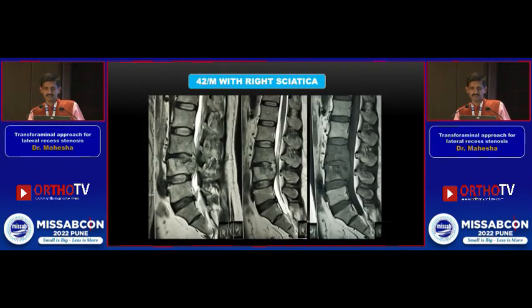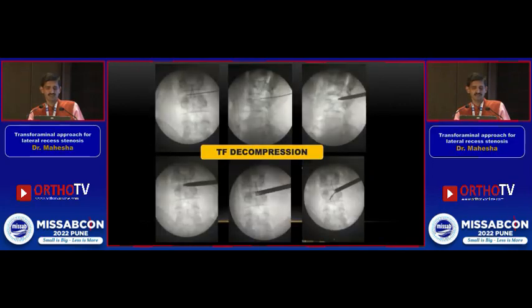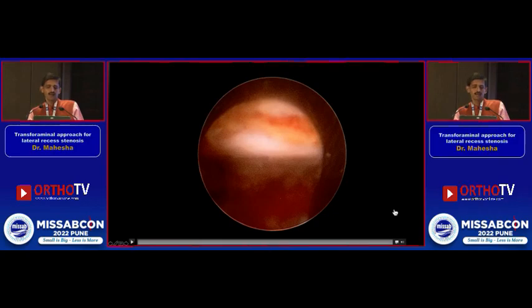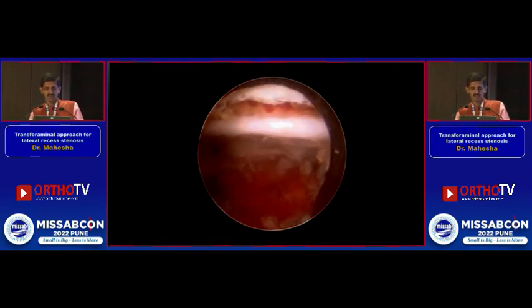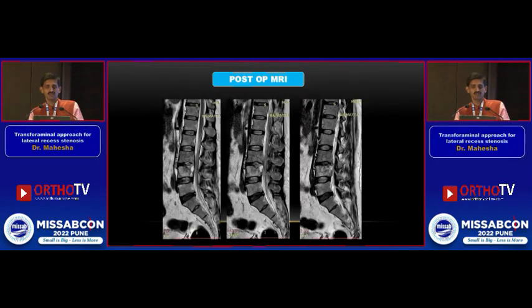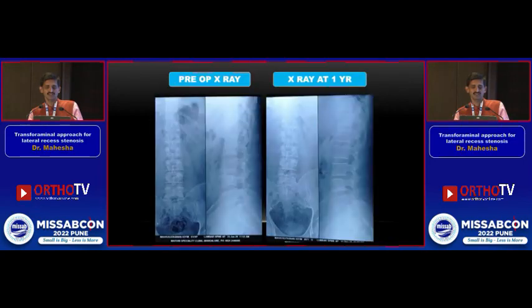This is the last case: a patient with tuberculosis spine on anti-tubercular treatment with severe radicular pain. At L3-4 level you can see the granulation tissue compressing the dura. This was done endoscopically, because the other option probably for him would have been fusion. At the end of decompression — it was not pus, it was all hard granulation tissue which required removal. You can see how beautifully decompression can be achieved with the transforaminal approach. This is the post-operative MRI immediately post-op — you can see all the granulation tissue decompressed. At one year, the disease has healed very well with anti-tubercular treatment and the canal is restored to normal size.